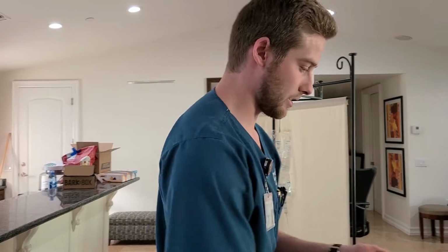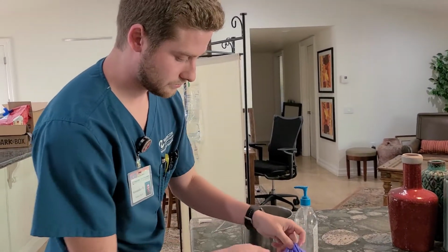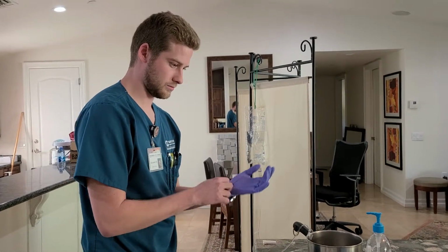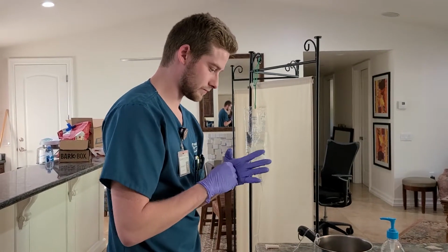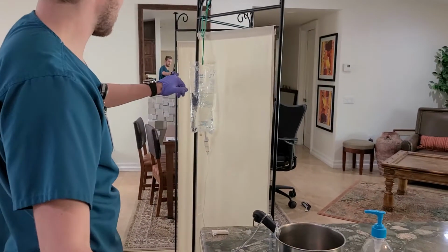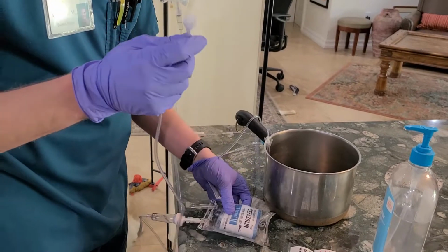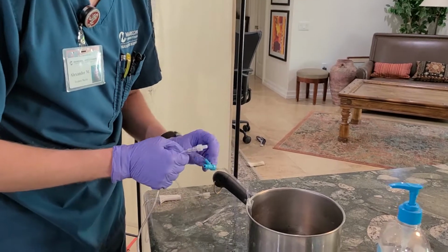No. Okay. So now I would wash my hands. I will put on my gloves. So now I'm going to make sure that this is hanging lower, and that's the right solution here. We have the right one hanging and it's dripping. So now we're going to take this here and we're going to start attaching the medication. And since we're hanging it via gravity, I'm going to hook it to the closest one here. So I'm going to grab a hold of the port.